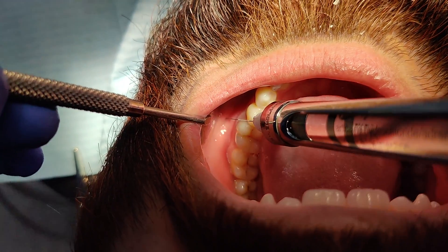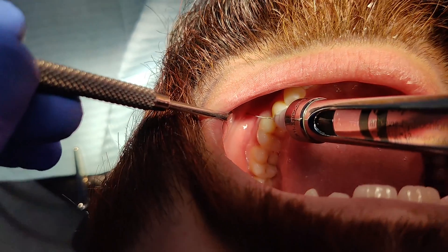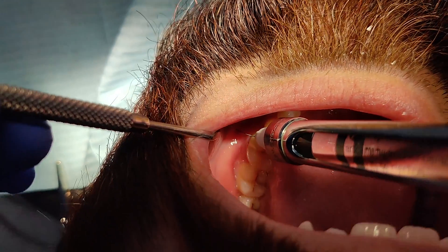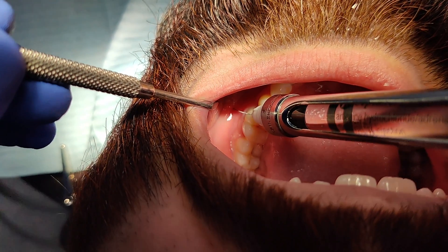The way that you can give LA painlessly is by actually moving the tissues, or asking the patient to rotate their head into the needle, instead of keeping the patient still and plunging the needle through the tissues. The reason it's more painless to get the patient to move into the needle is because there is less resistance on the needle.